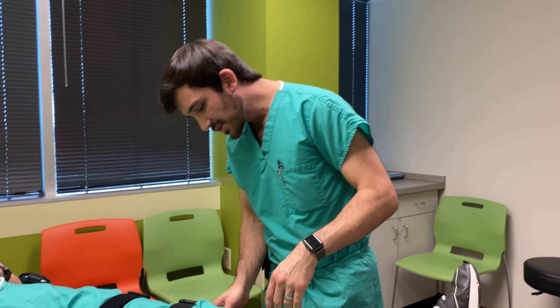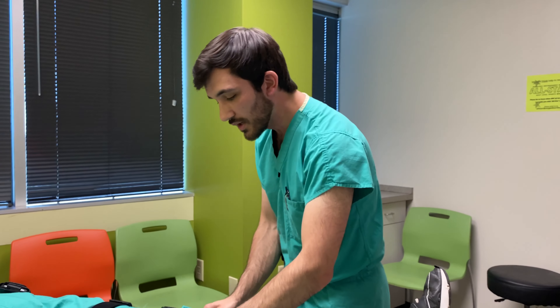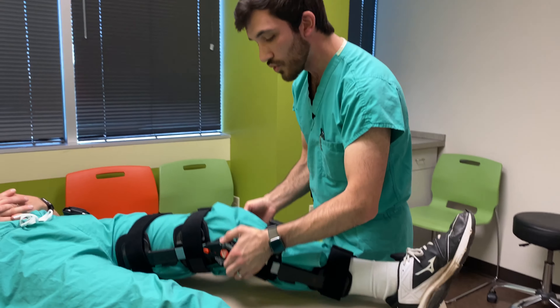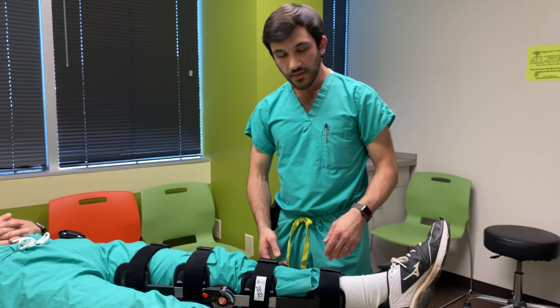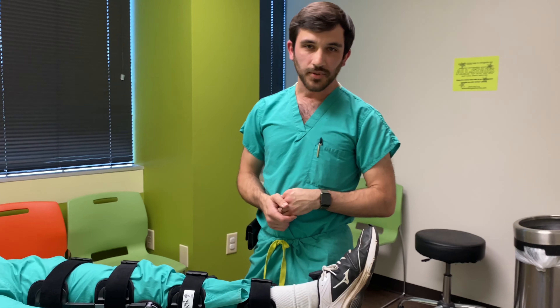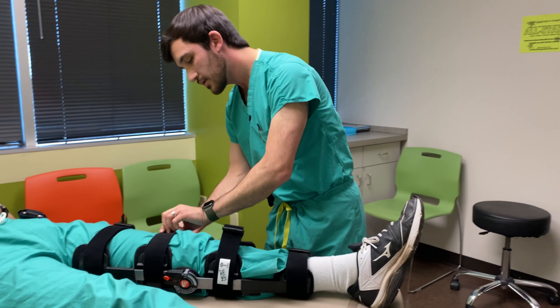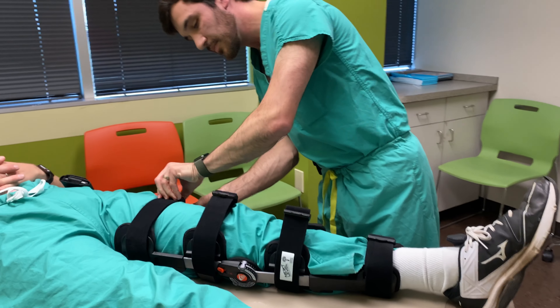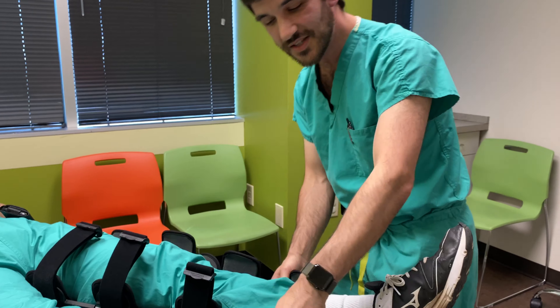It's important to note that once you've done this setup, you're ready to go. The surgeon or healthcare provider will help tell you how much the knee can bend and straighten, and then the removal and reapplication of the brace is simple — all you have to do is undo your clips. I hope this makes what can sometimes be a daunting task a little bit easier. Thanks.